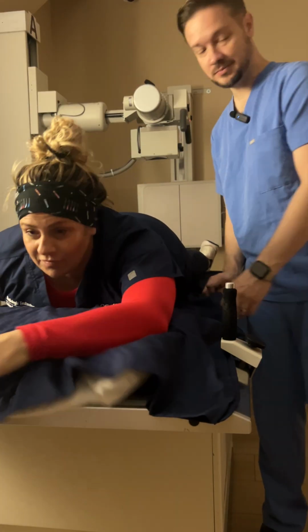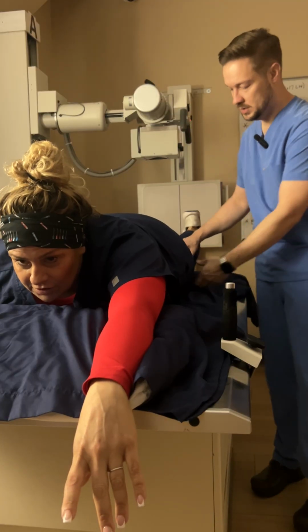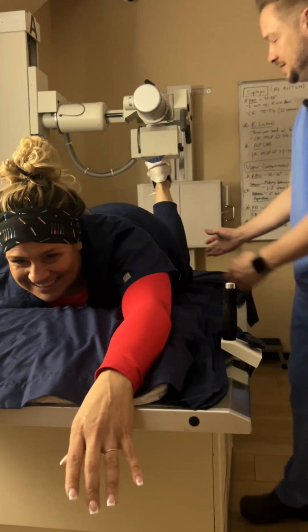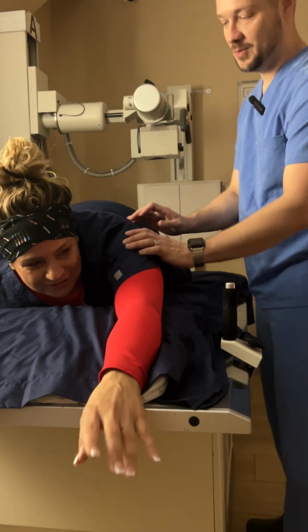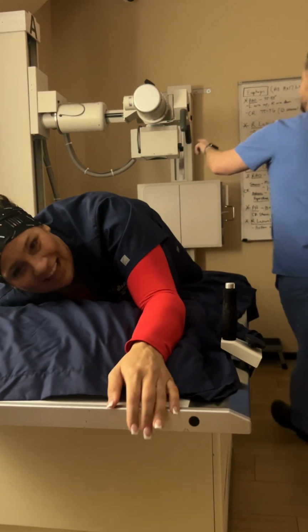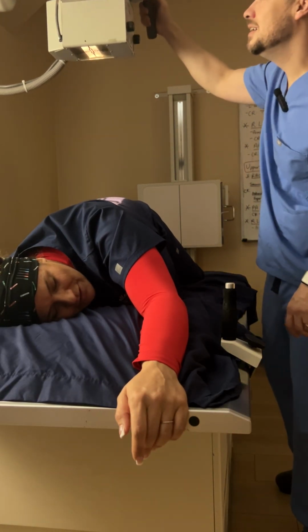There you go. You're going to have the patient rotate slightly away from you, okay? So bend this knee up just a little. Bring it up alongside you. Bend it up. There you go. Rotate your body. Bring that leg down, and now rotate your body.